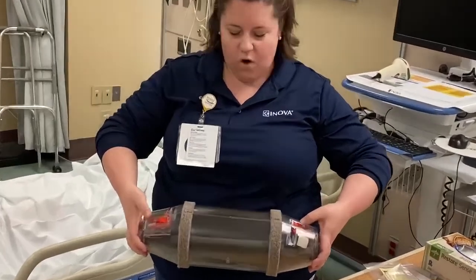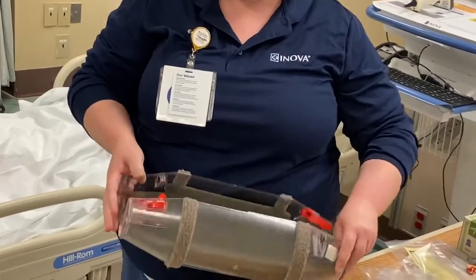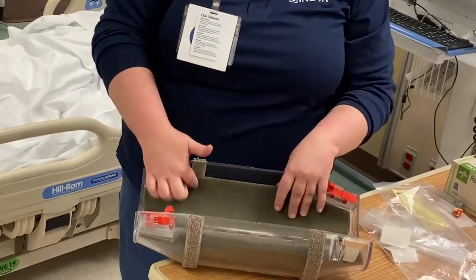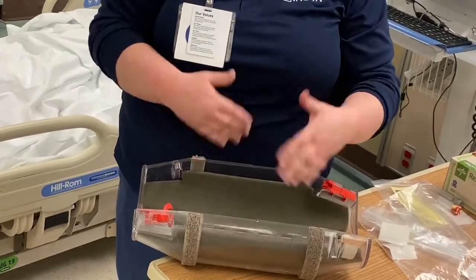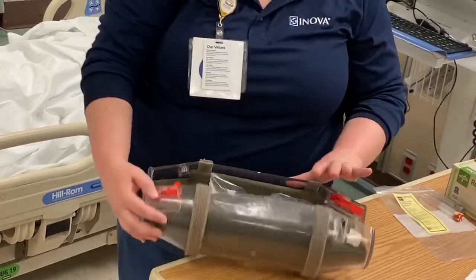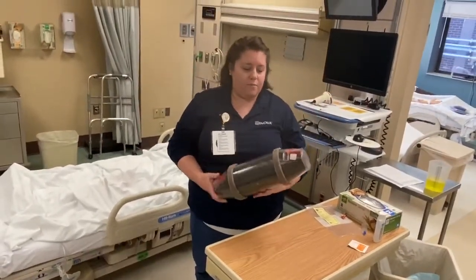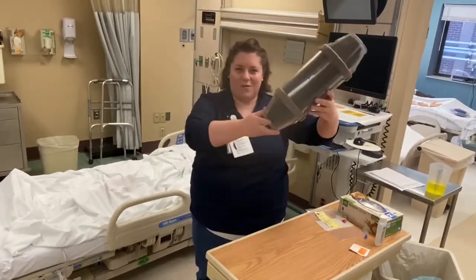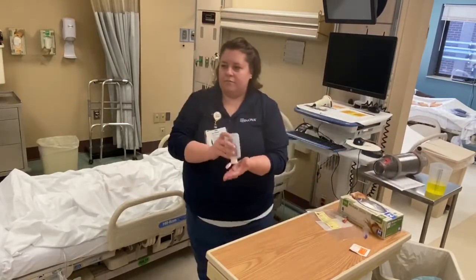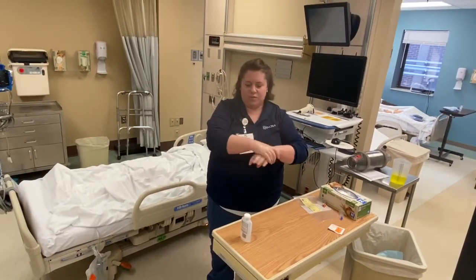If not, the way you open it is you grab these red pieces right here and you pull and it will open up. Whenever I'm sending a specimen, whether it's blood, urine, anything, I want to make sure that the tube has padding in it so the specimen doesn't jostle around and potentially open. So I'll just put this inside like this, close it up, and then I will send it to the lab based on the number of the lab, put it in, and it will send away. And make sure the tube goes before you leave. Don't just leave it in the tube station.